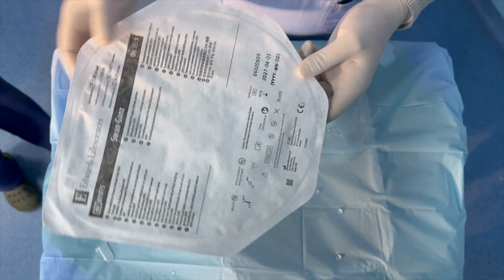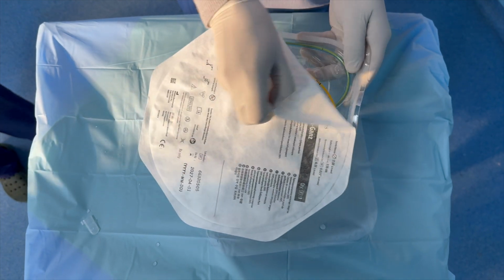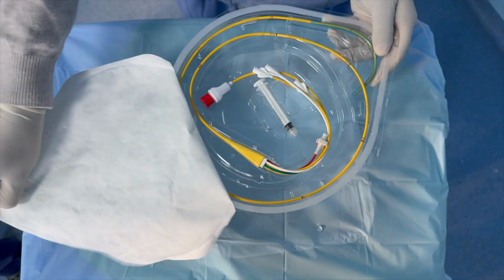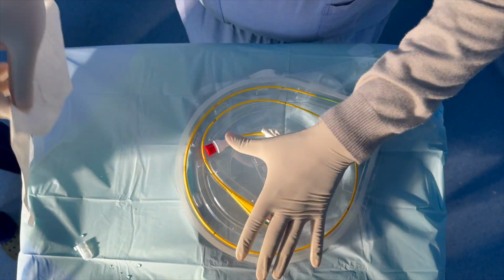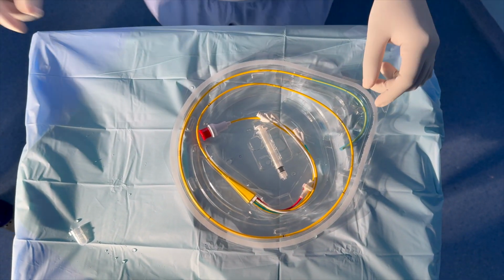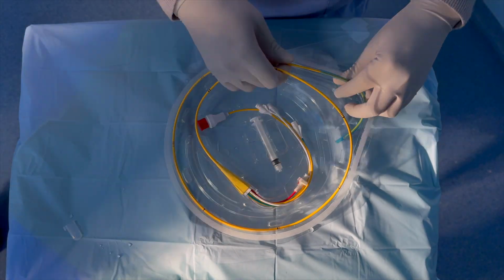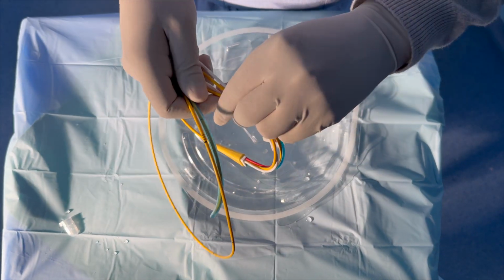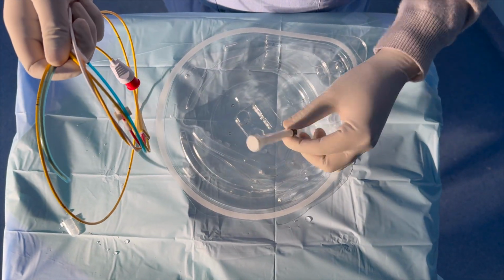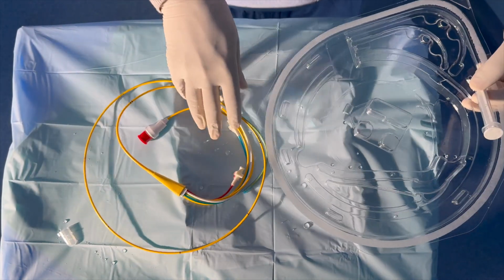Now open the second covering. In this covering you can see two items. One is the PA catheter and the second one is the 1.5 ml Luer lock syringe.